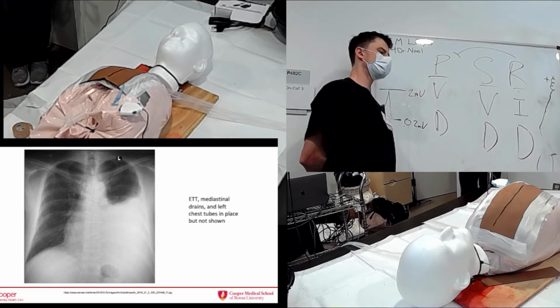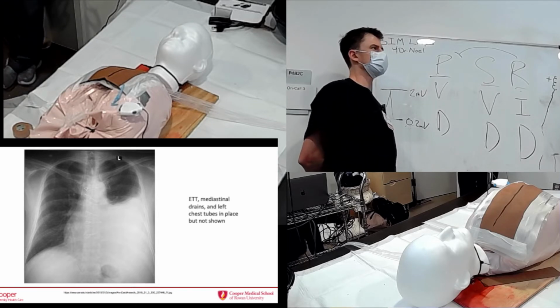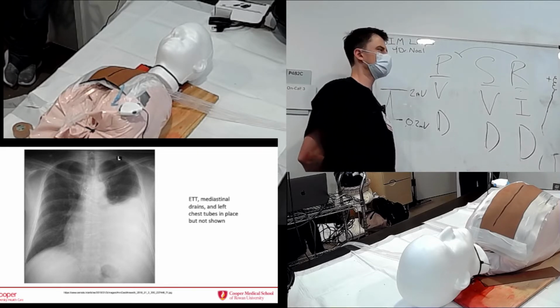Okay, surgeon's 30, 45 minutes away. It's 60 over 40. The tubes aren't draining. There's a big left pleural effusion. It's like two-thirds of the chest. So the tubes are not draining? Not draining. Okay, so we'll either try to strip it. If it's not working, then you have to put in a chest tube. All right, let's put a chest tube in.